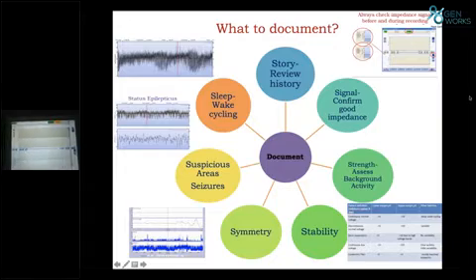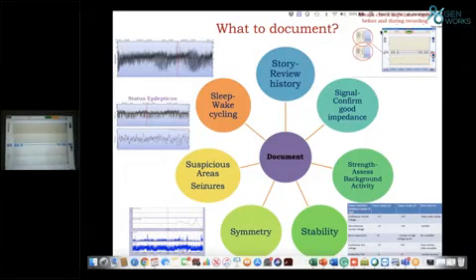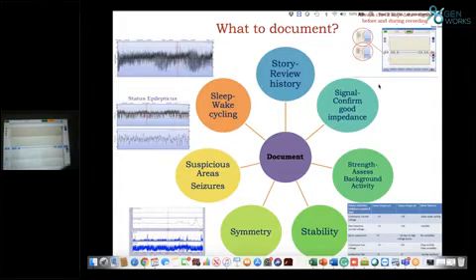That I am showing you right now, that impedance is coming. Almost it is green now. Yeah, that means that is signal. The other one, which we discussed beautifully yesterday, is going to be spoken about by somebody else here. What is the CNV? CNV means continuous normal voltage, discontinuous normal voltage, burst suppression pattern, continuous low voltage, flat trace. Yesterday what we discussed, they're going to discuss in short today.